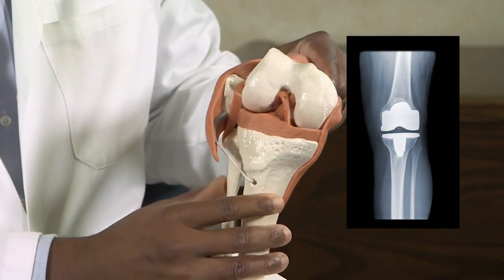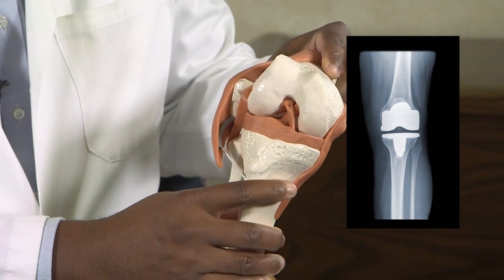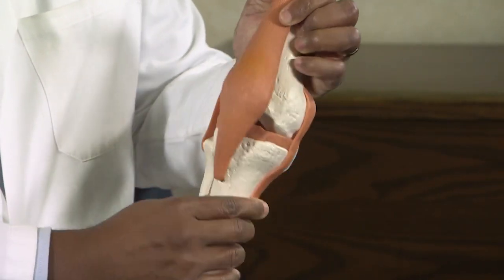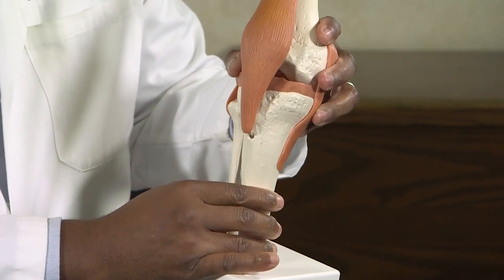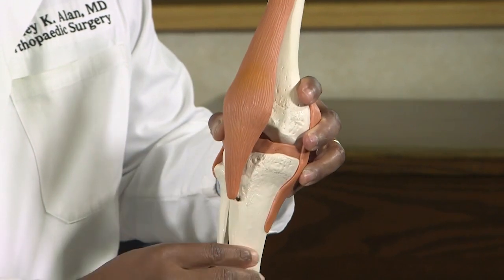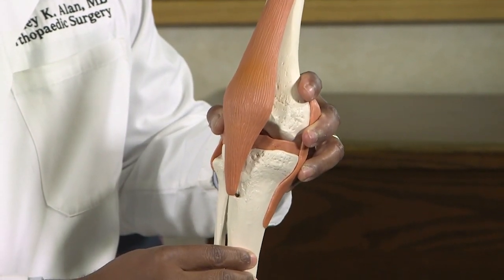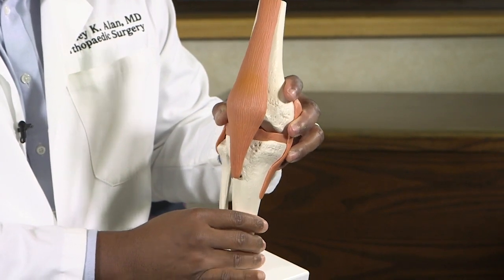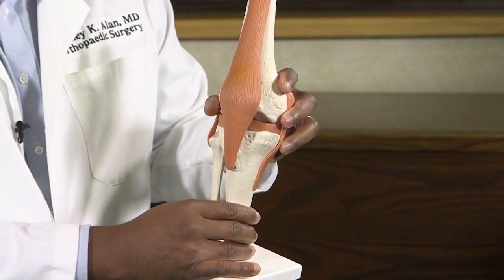After we've resurfaced each of the components, we will reduce the knee, put the quadriceps back in front of the knee, and repair this arthrotomy on the inside part of the knee. Following that, we'll close the skin, and that's how we perform a knee replacement.